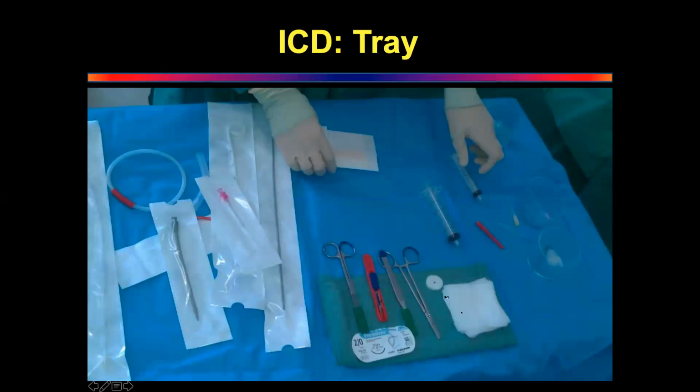Good. What is this? This is a needle holder. Straight artery forceps. Yes, it's for dissection. Then it's an 11 number blade. What is this I'm pointing out? It's a BP handle. It's a forceps. Okay. What is this?